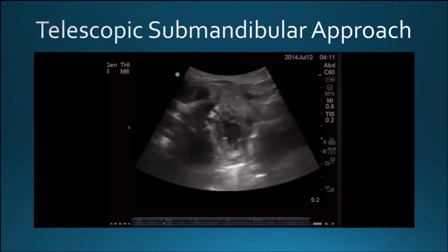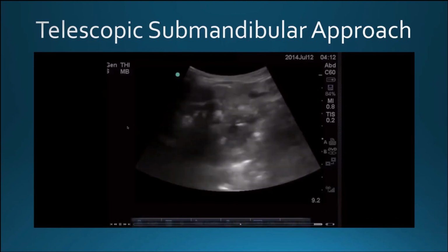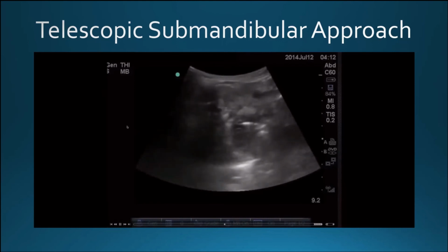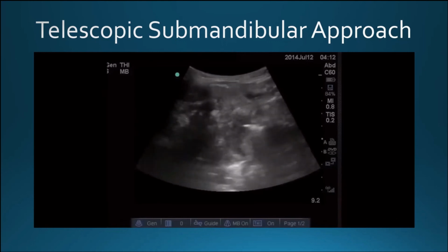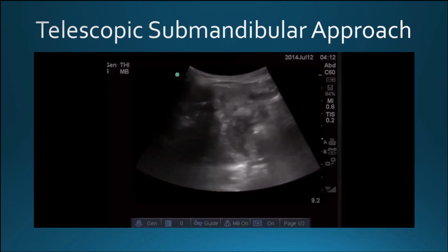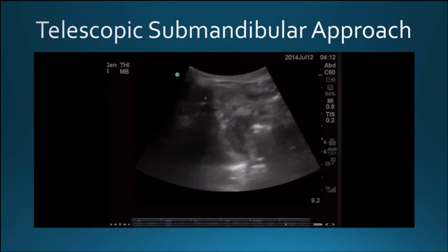And now he went ahead and is actually going into the abscess, and you can see the abscess is collapsing, and you're seeing this in live view. You're able to watch all the contents of it come out. You're still visualizing the needle tip there. You've got your vascular structures over here, everything's safe. And that's it. The needle tip's still there. I stopped the video, but you can see right there as the entire capsule pretty much collapsed.